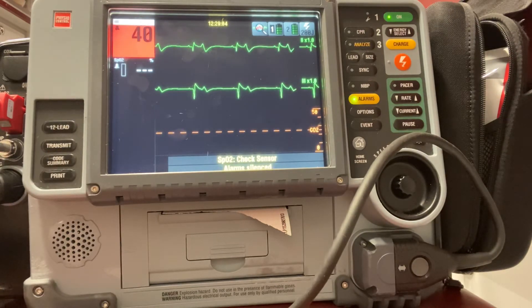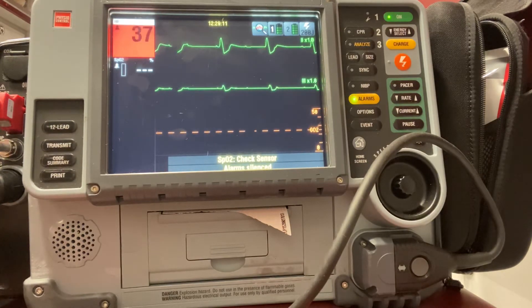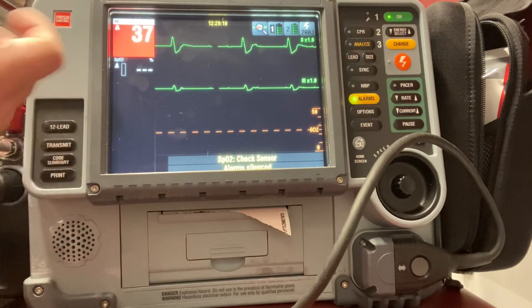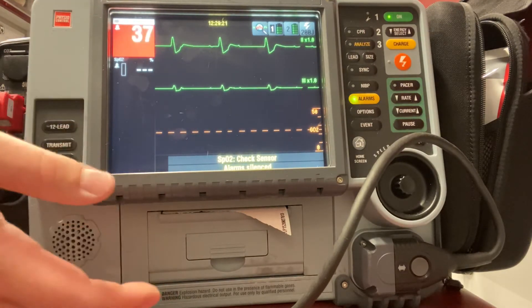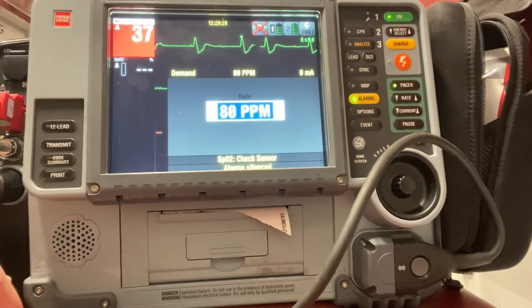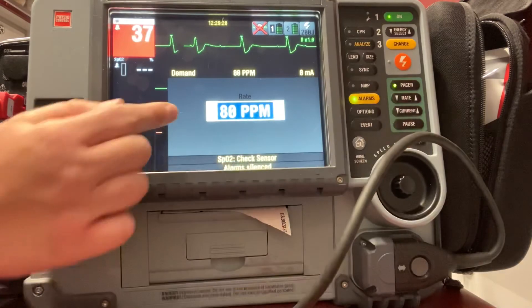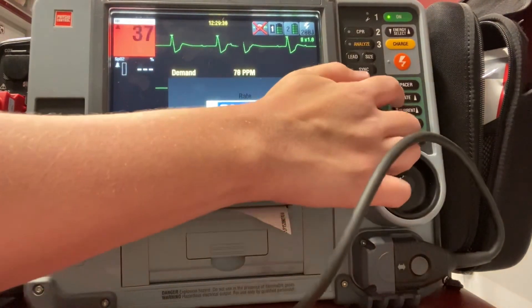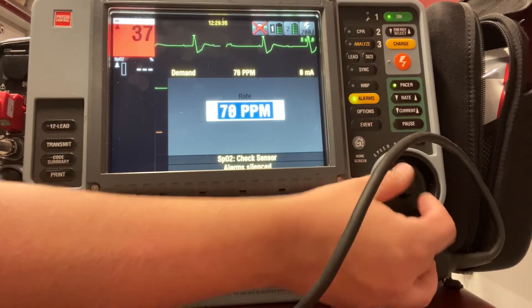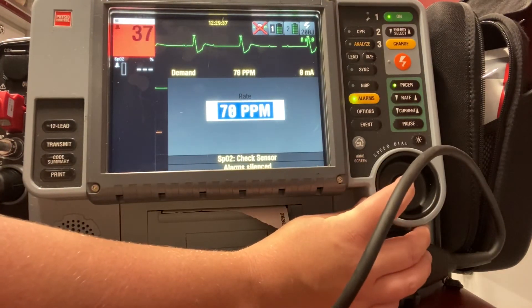Now I want to show you the process one more time, and I'll do it with a heart block this time. Pacing works with any bradycardic rhythm as long as you can get capture. This is a third degree heart block and it's very bradycardic at 37 beats per minute. This patient is very symptomatic, so again I want to pace them. I'm going to press pacer — it's going to prompt me to set my pulse per minute using the toggle or the dial. I'm going to go down to 70 pulse per minute and press in on the dial.